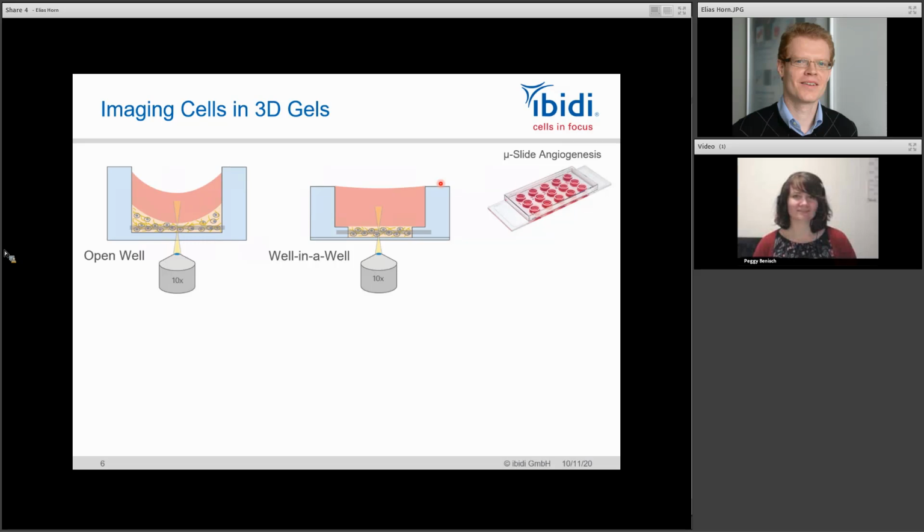There are cells which digest the gel matrix, of course. As you've seen in the video, the gel is changed over time by those fibrosarcoma cells, and because the cell number is also changing over time, some cells are digesting the collagen, some cells are not. It very much depends on the combination of cell type and gel.